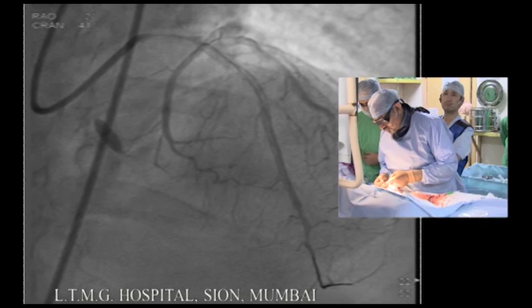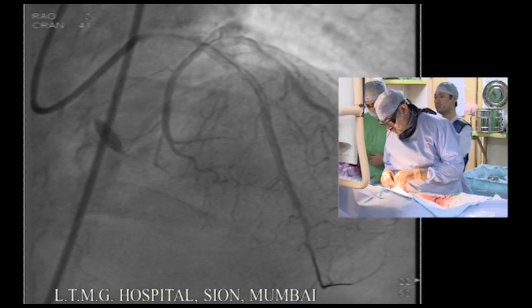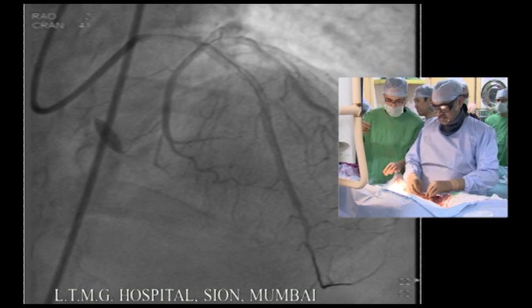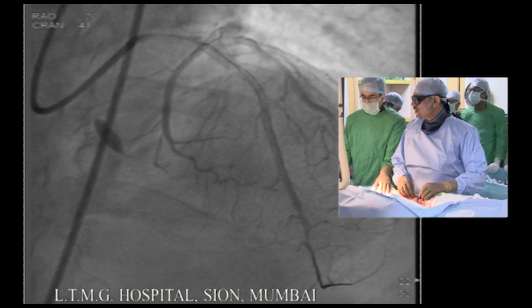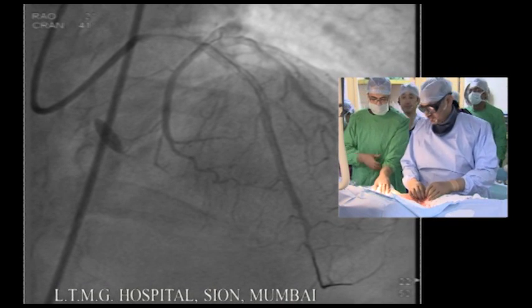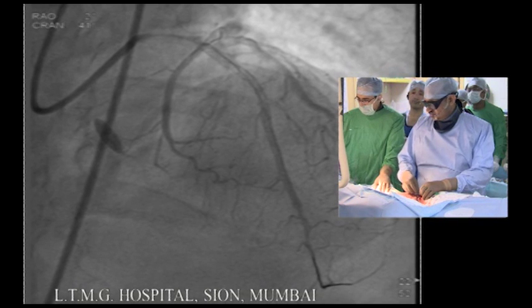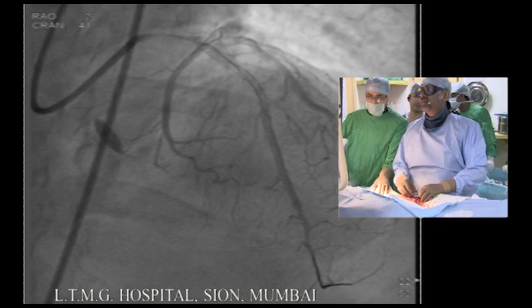IVUS does not go in. What is your comfort level? Use a rota. If you are not comfortable with rota, or if you don't have rota, take a small balloon, small and long. Go only 5-6 atmosphere, take it out, put the IVUS back in. And right now, I think the distal end is hazy, but you don't want to change the outflow because the change will end in the tip of the LAD. So I think just do proximal optimization and get out of the case. 3.25 balloon, free balloon.